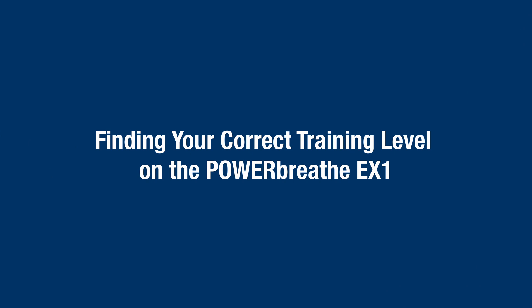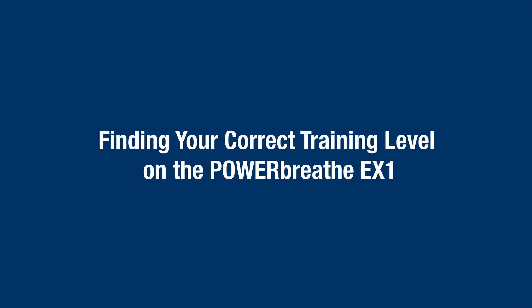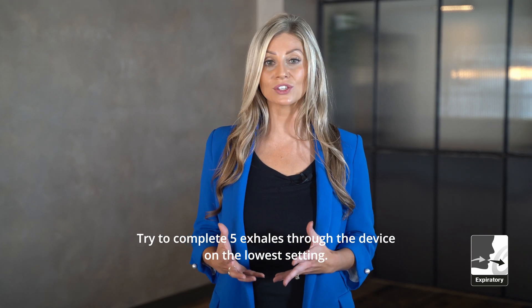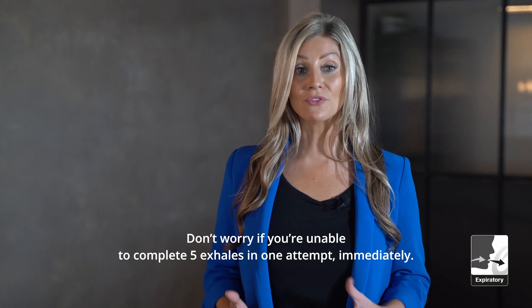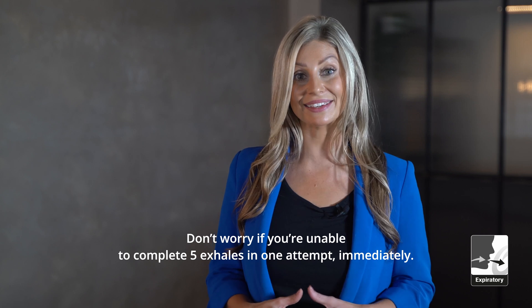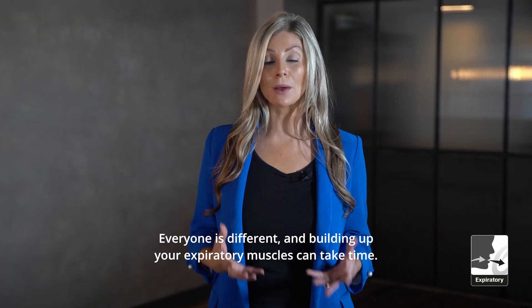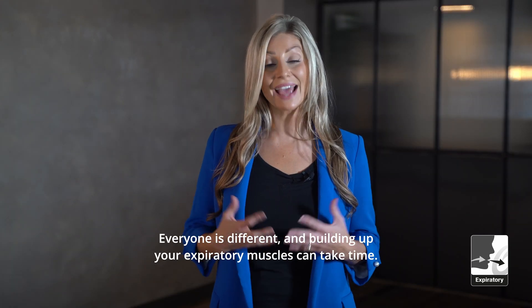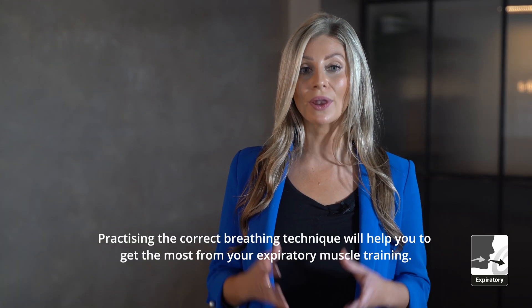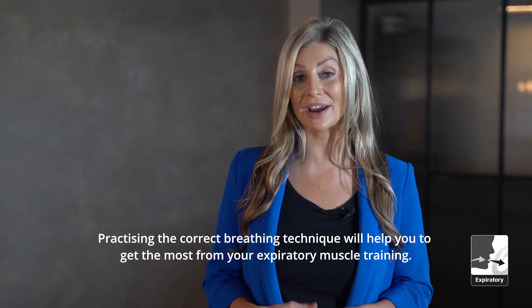Finding your correct training level on the PowerBreathe EX1. Try to complete five exhales through the device on the lowest setting. Don't worry if you're unable to complete five exhales in one attempt immediately. Everyone is different and building up your expiratory muscles can take time. Practising the correct breathing technique will help you get the most from your expiratory muscle training.